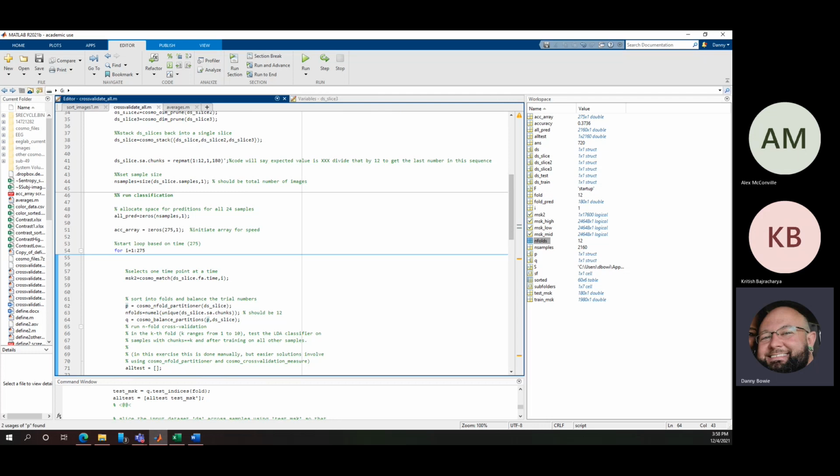The classification algorithm we used is called linear discriminant analysis, LDA. The way it works is to try and draw a boundary between the two classes based on the training data. To overcome noisy data, we use lots of trials and average across them.